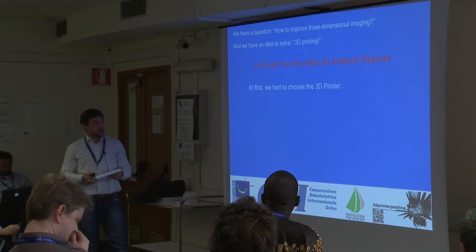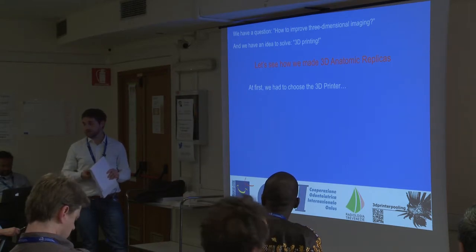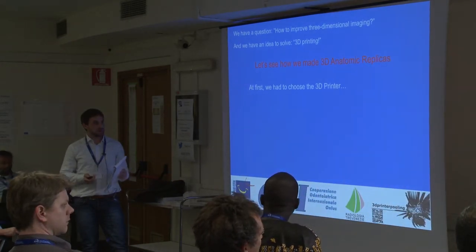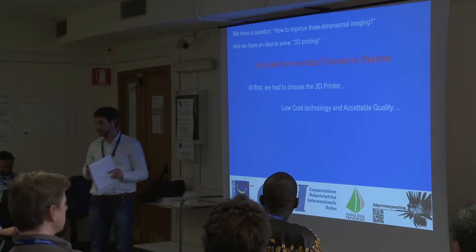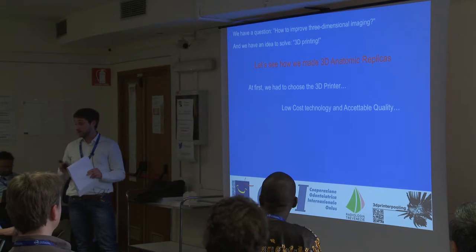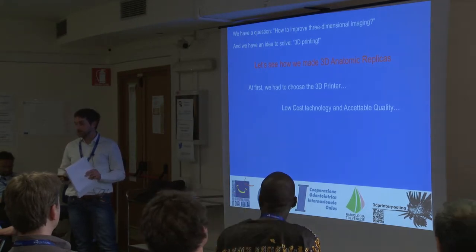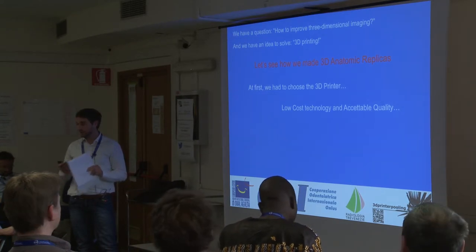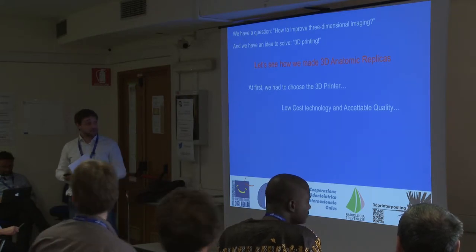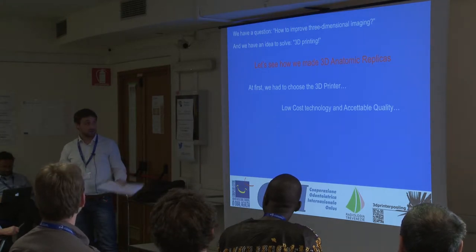The first problem was to choose the right 3D printer, because we have two ways. The first way was an expensive way with expensive technology like laser technology with dust, different materials, or the other way was to choose low cost technology.